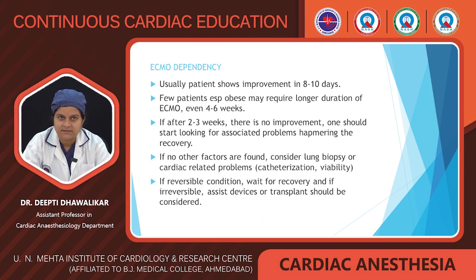Now coming to the last complication, it is ECMO dependency. Usually the patient shows improvement in 8 to 10 days after institution of ECMO. Few patients, especially obese, may require a little longer duration of ECMO, even 4 to 6 weeks. If after 2 to 3 weeks there is no improvement, one should start looking for associated problems hampering the recovery.